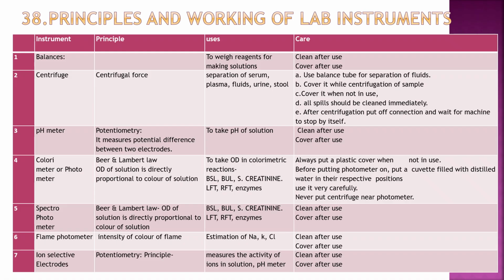Photometer, same machine, but it is mostly fully automated or semi-automated. Flame photometer, estimation of sodium, potassium, chloride. The luminous strength of the flame is measured. Ion selective electrodes, potentiometry, measures activity of ions in the solution, like the pH meter.